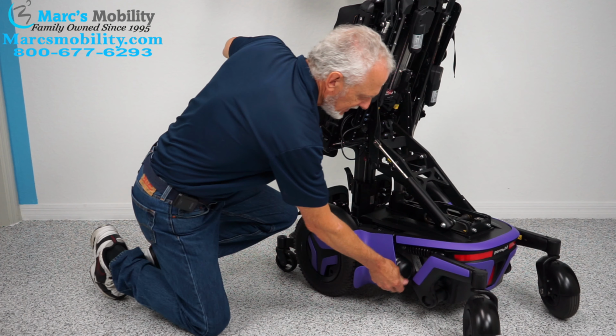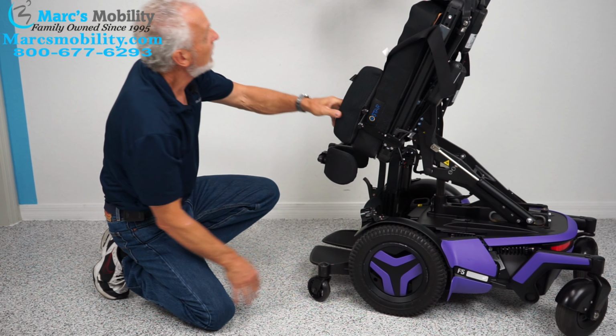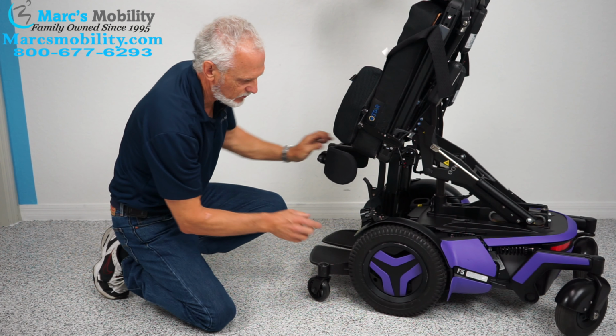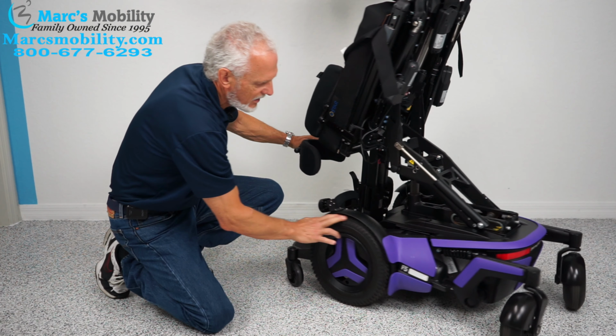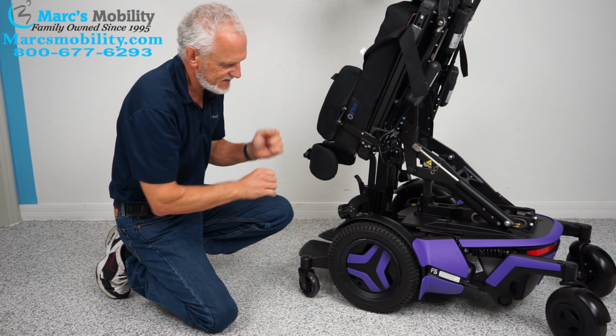So I'm showing it to you this way now, but if I want to push it, all I have to do is push the lever down. And what that does, it unlocks the wheel, okay? Oh, I forgot. Turn your power off. That's why there was resistance in the motor. Now if I put it back, see how much easier it is? Look at that. So if you leave the power on, you're going to have resistance in the motor.